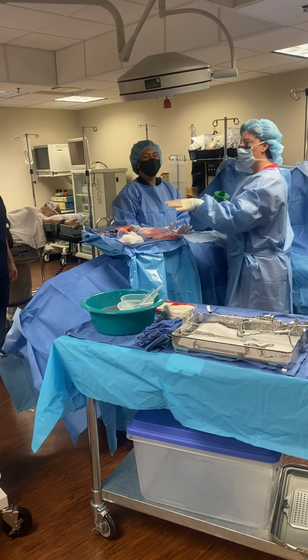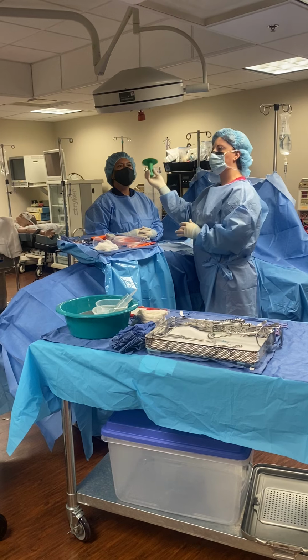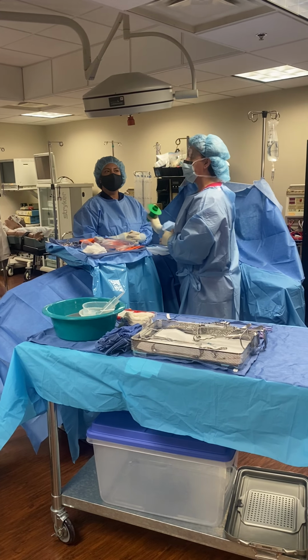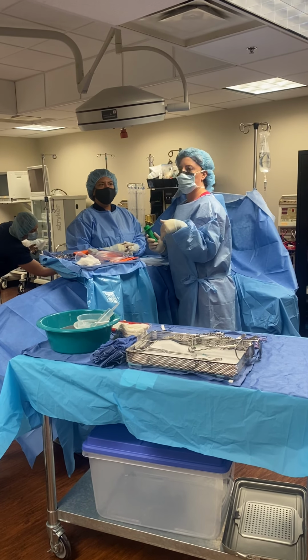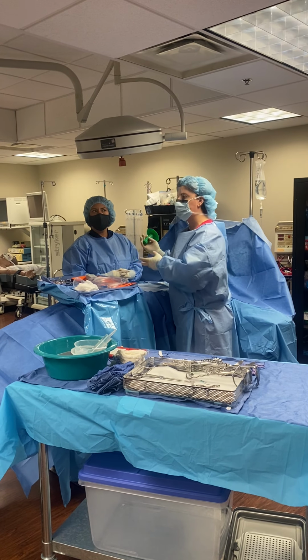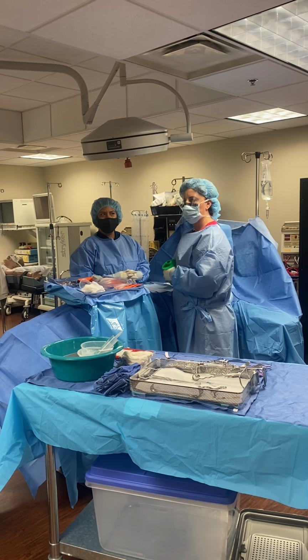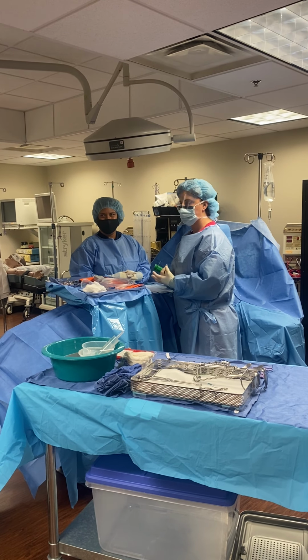All right, so a couple things we have to do before we get ready. I put a couple sponges on the field, and then we're going to put our light handle on. Sometimes we'll just pass it off to the surgeon, but for training purposes, we'll have you guys do it as the surgical check. But you definitely can too. The surgeon will usually help you, but we're not going to. We're just going to stand there and be lame so that you get your practice, right?